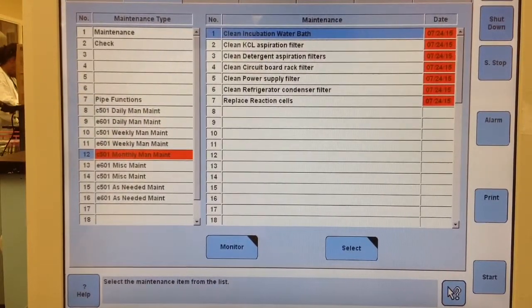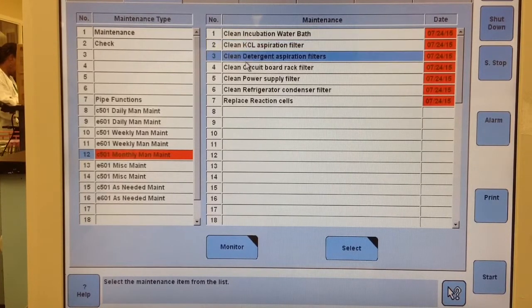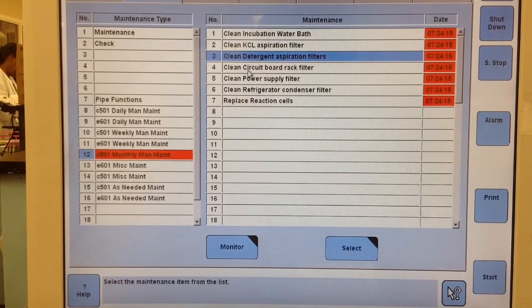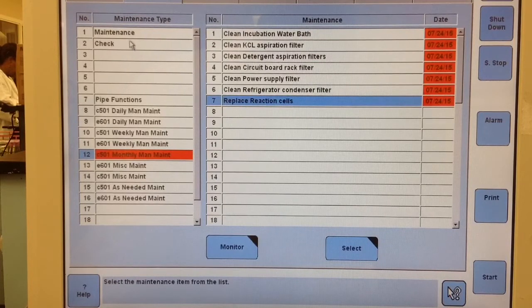A quick overview of what the monthly maintenance includes is incubation water bath cleaning, cleaning the KCL and detergent aspiration filters, and various other filters around the machine. In conjunction with the incubation water bath cleaning, we're going to replace the reaction cells.